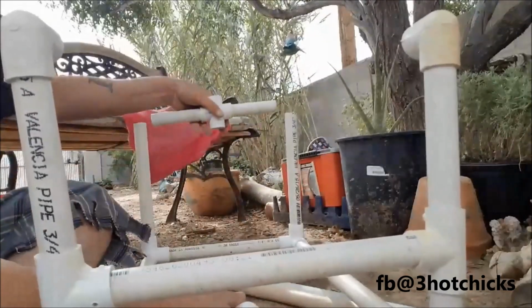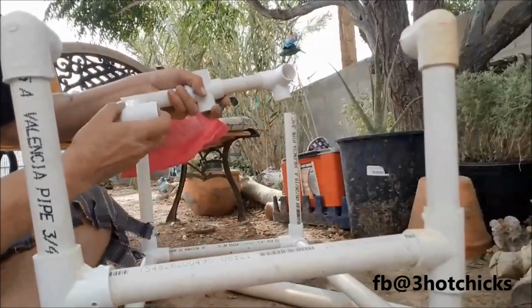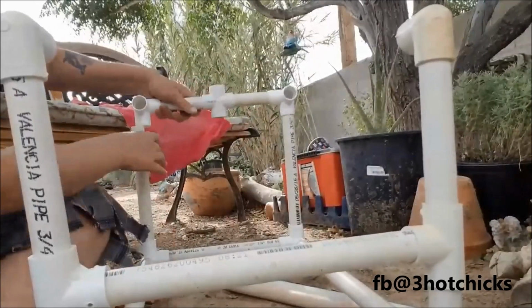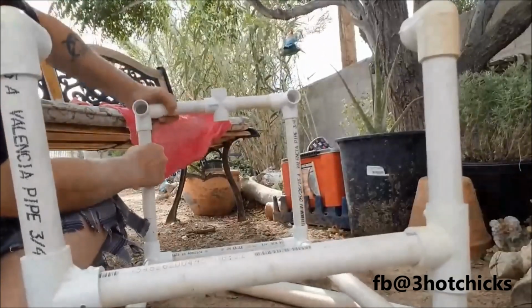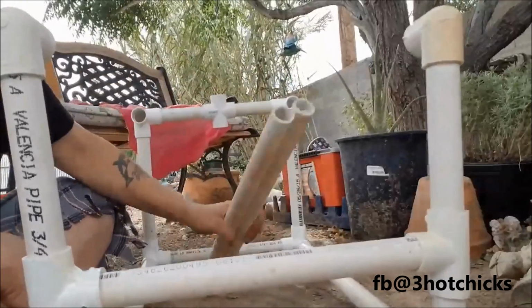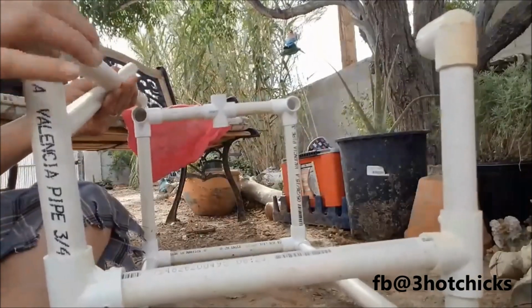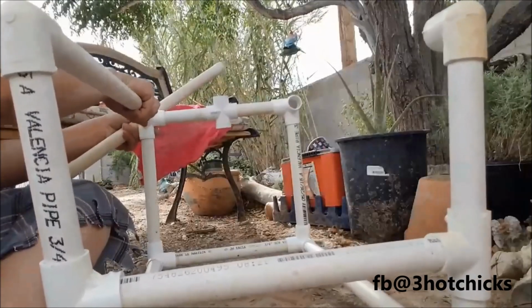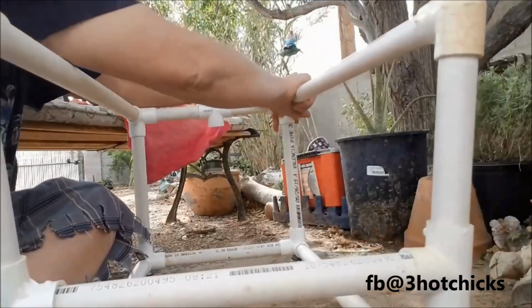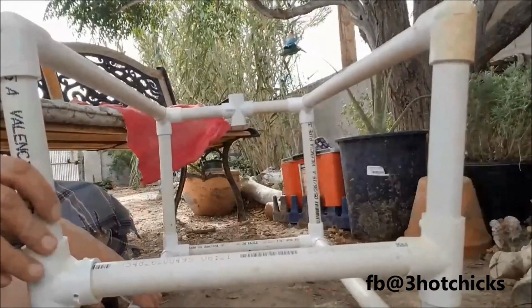So then you attach this back part, you put your three-way fittings on it, right there, attach it to the top of the sling, and then we've got our two remaining link bars that we're going to attach right here. Right there, and one right here, and bam, it's done, pretty much.